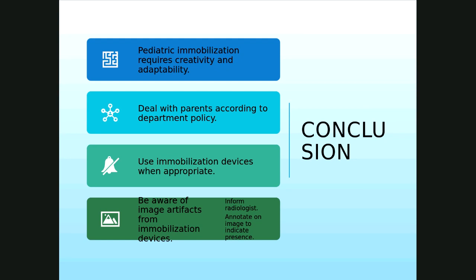Have to take 3 chest x-rays and you've just radiated my child 3 times. Now, I know better because I am a technologist. Some lay people do not know better, but just think, for the safety and radiation protection of your patient, whether they're pediatric, geriatric, or somewhere in between, you always want to adhere to that ALARA principle, even if it means having a baby cry for 20, 30 seconds. That's okay. In the long run, consider the radiation dose to that patient.